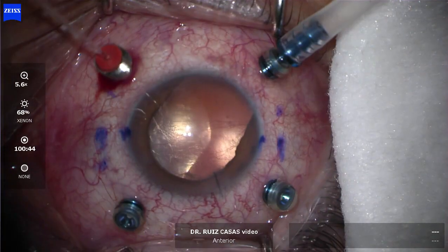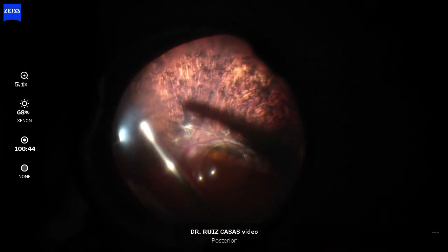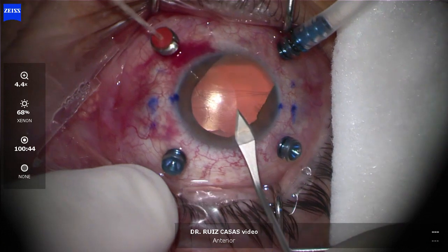It opened the inferior gap and the IOL migrated into the vitreous cavity. You can see the large trauma to the retina that occurred after the ocular trauma. Now performing the vitrectomy, you can see the nuclear remnants.